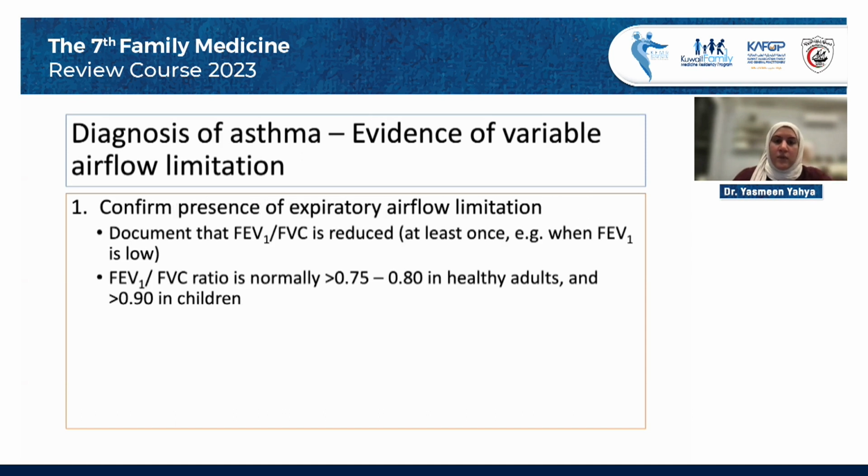So usually you need to document that FEV1 over FVC is reduced at least once through all the patient's visits or history, especially when the FEV1 is low.